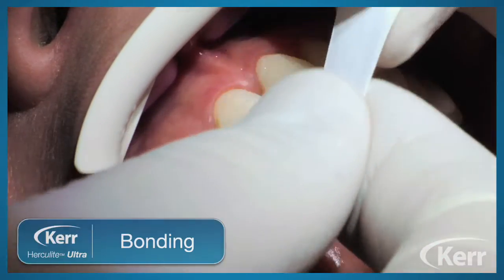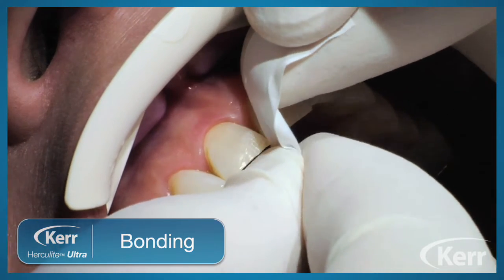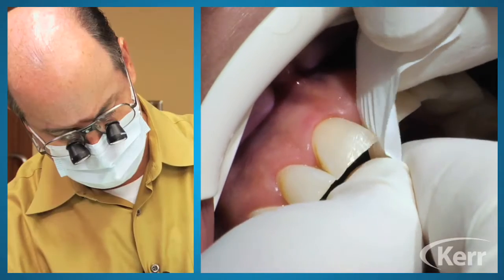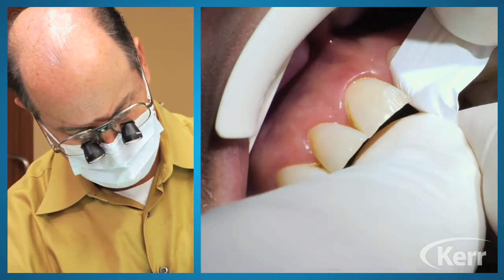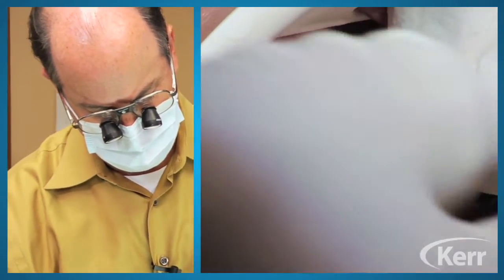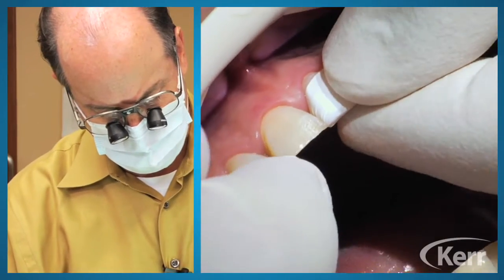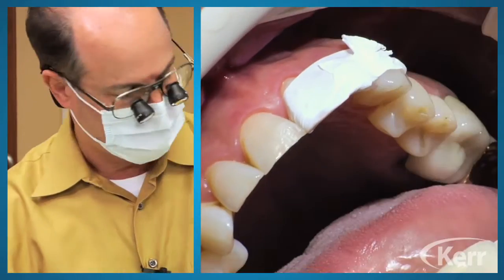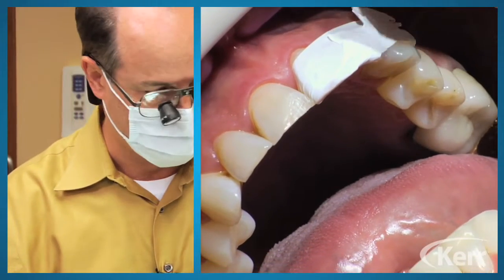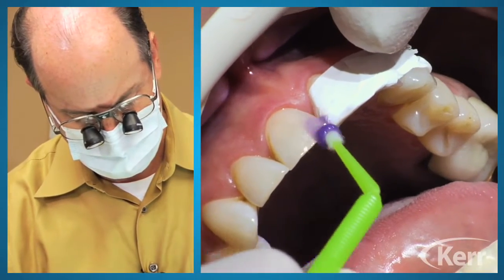I like to use a little plumber's tape just to protect the adjacent tooth. So try to get that in there, not having any wrinkles or crinkles on it. And this is nice and thin. You can get this literally at Home Depot for $1.40 for like 100 yards. So very inexpensive, simple stuff to protect the adjacent tooth while I go ahead and etch.